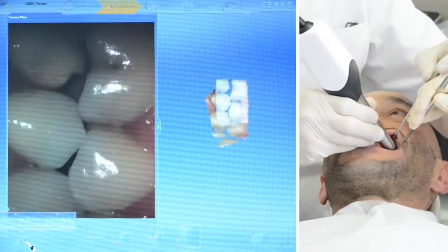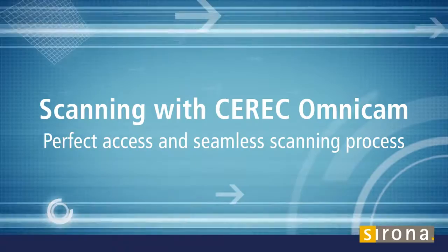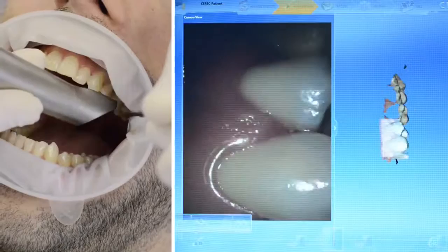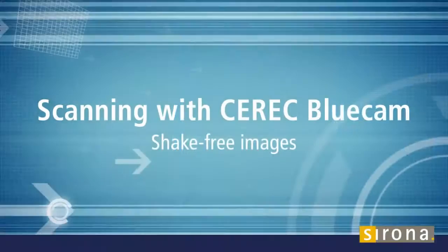The Omnicam requires no powder and is optimized for scanning natural tooth structures and gingiva, resulting in precise 3D scans in natural color. Both jaws can be optionally scanned before preparation, and the prepped teeth can be added to the virtual model later. The Omnicam has a small head which allows easy access to the posterior teeth, and the user simply moves the camera head closely over the teeth in a single flowing movement.